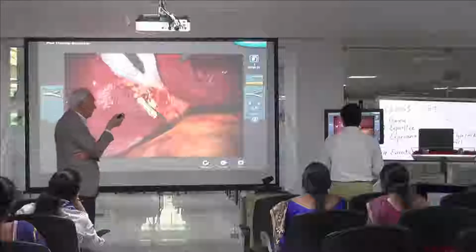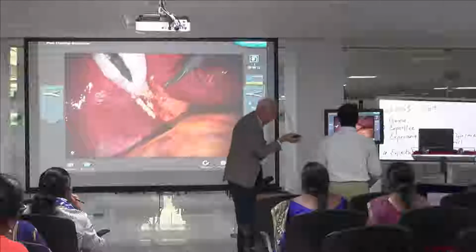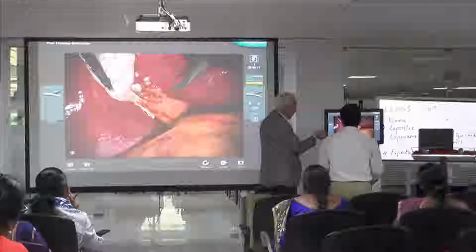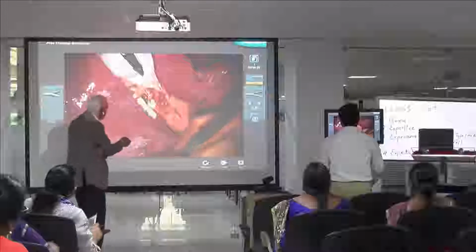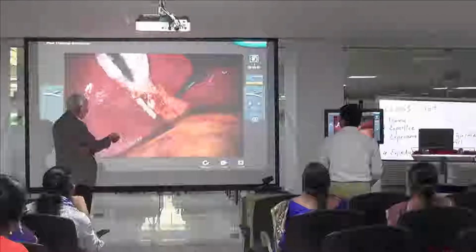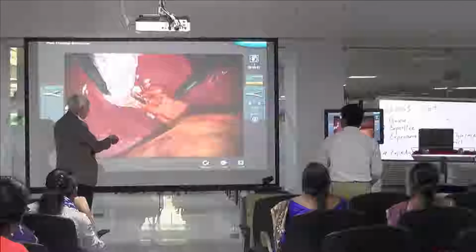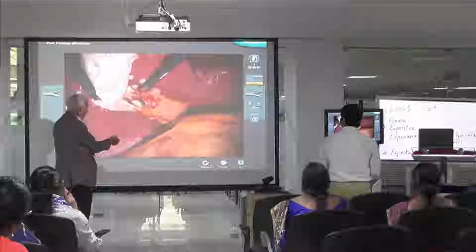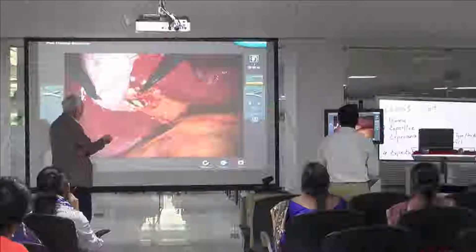So this component task is now okay, you're happy, I'm happy, and you avoided getting into the dangerous area, because this dangerous area is here, that is hilum, where the hepatic duct, common bile duct, and the portal vein, and the arteries are there, right, left, and hepatic artery, where you should not be because you can damage the structures.